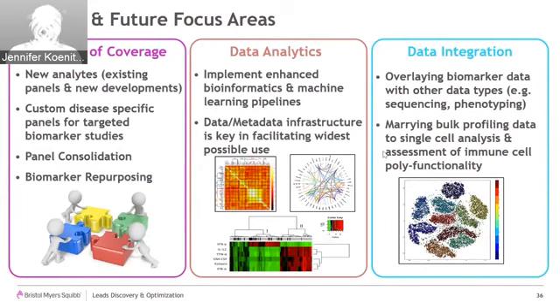So we are constantly trying to optimize our data registration and database models or build new systems to handle these types of data. This is also key in facilitating enhanced bioinformatics methods for data analysis, as well as efforts to implement machine learning, particularly for generating disease predictive biomarker signatures.